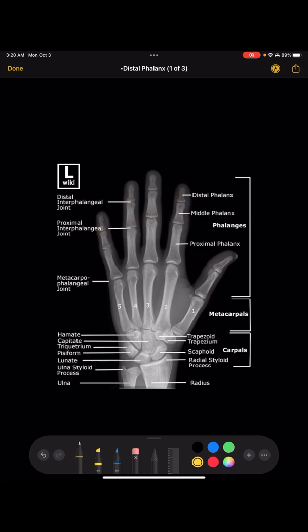For a PA hand, you want it to be non-rotated — everything needs to be totally flat on the board. The technical term is equal concavity on both sides, meaning the curves on each side of the metacarpals and phalanges are approximately equal to each other.